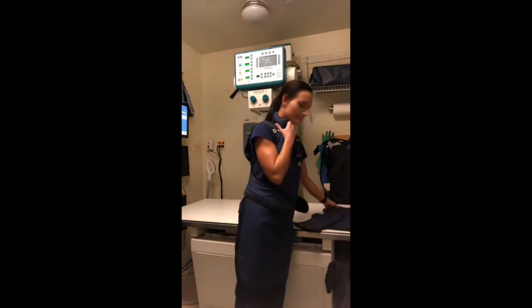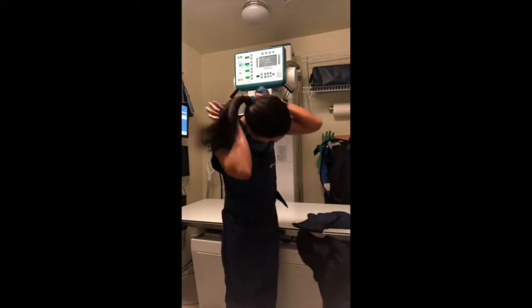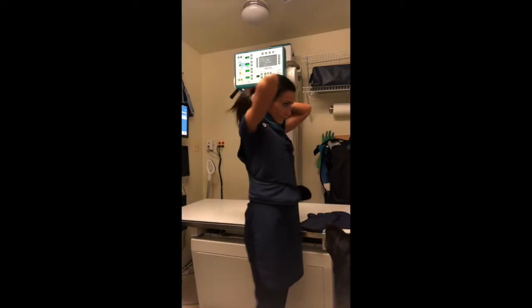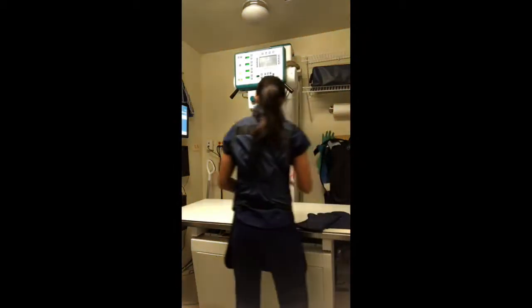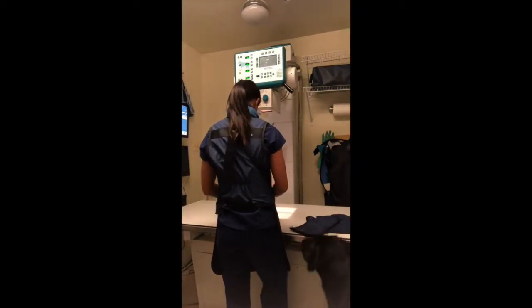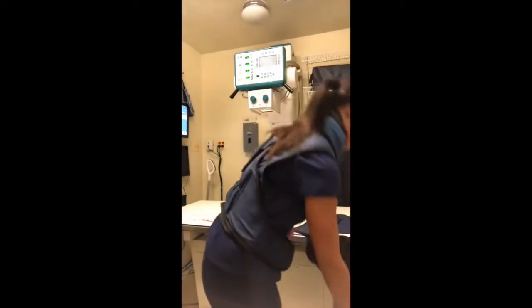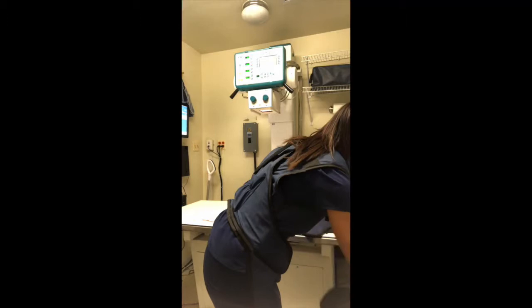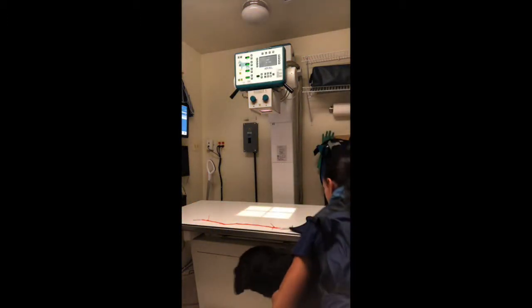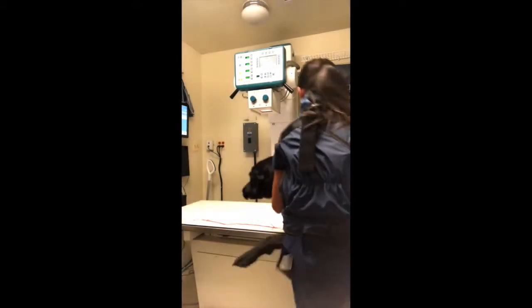The pros include rapid transit time, non-irritating to the mucosal surface. It's readily absorbed from the peritoneal cavity. If there's leakage, it can be absorbed across the mucosa and excreted by the urinary tract. The cons include its bitter taste, it's expensive, its hypertonicity can cause fluid movement into the lumen, dilution of the contrast medium, electrolyte imbalance, dehydration, nausea, vomiting, and decreased blood pressure.